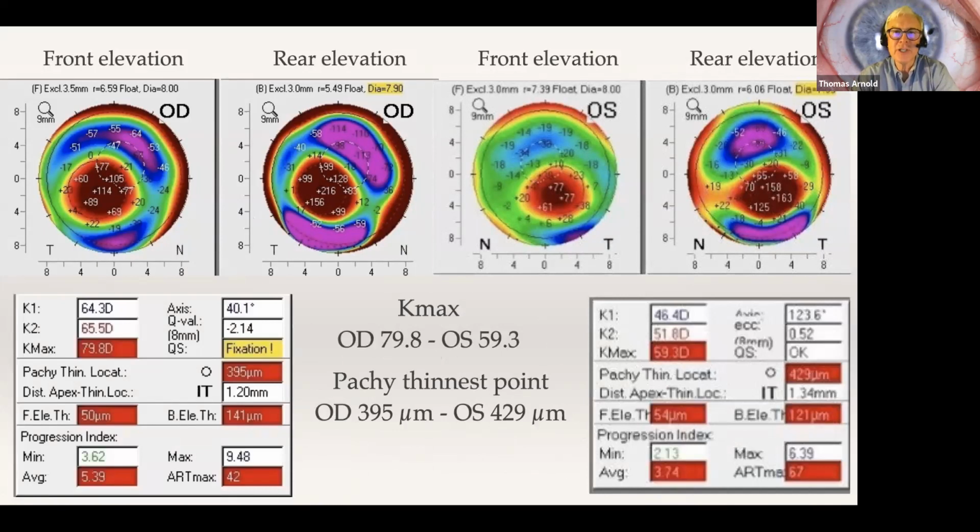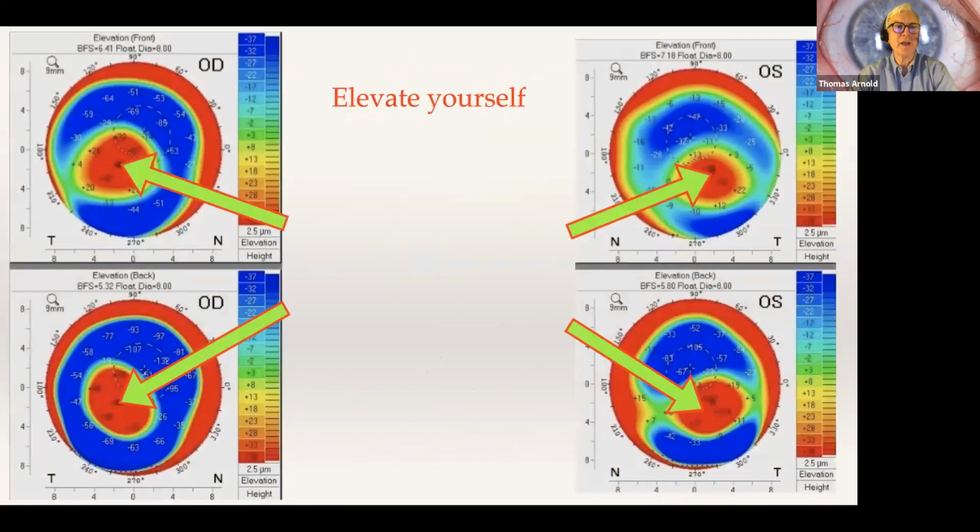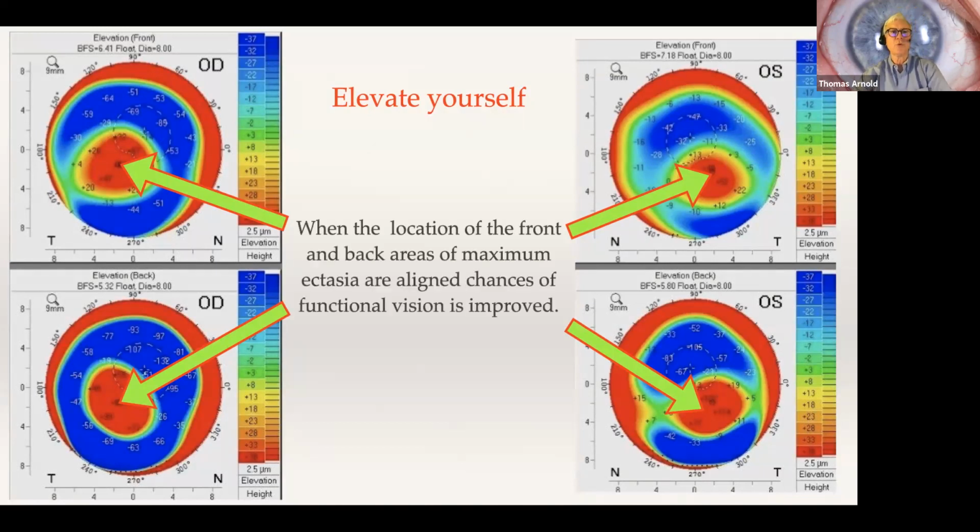But what drives this case is elevation, okay? And that's what I want to focus on here. All right, elevate yourself. You have front surface curvature, you have back surface curvature. In keratoconus, it's generally acknowledged that the ectasia occurs on the back surface. And so it's possible to have a fairly symmetrical or smooth anterior surface, but a very asymmetrical ectatic back surface. And this is why a lot of these patients are not picked up earlier when you're using general topography, okay? So think of the elevation, get comfortable with what's higher than the best fit sphere, what's lower.